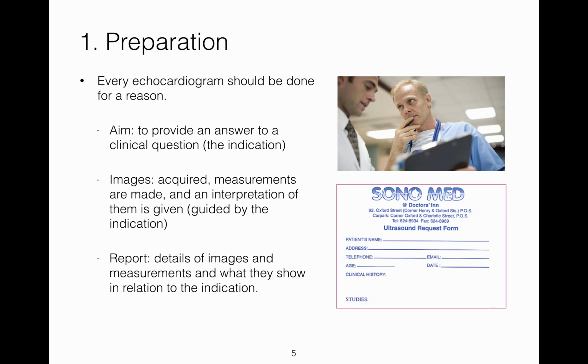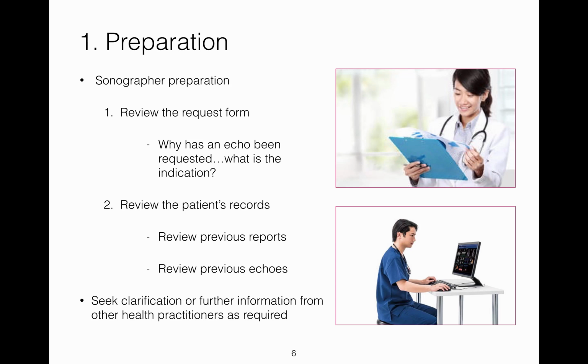The report at the end of the exam should give details about the images and measurements and what they show in relation to the indication. Before commencing each exam, the sonographer needs to prepare. First, one should review the request form, which should state the reason for the examination.